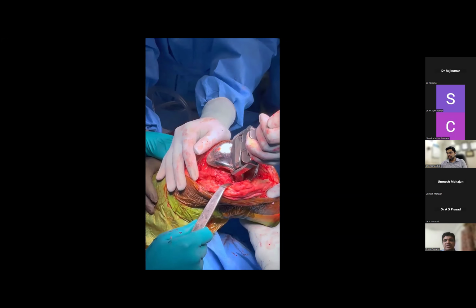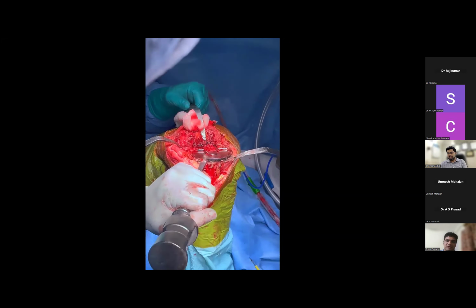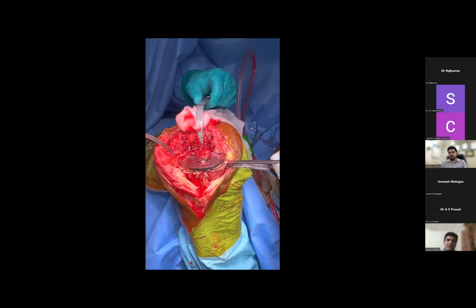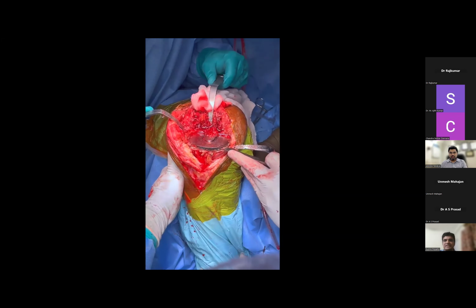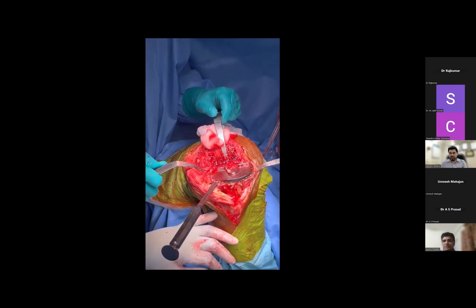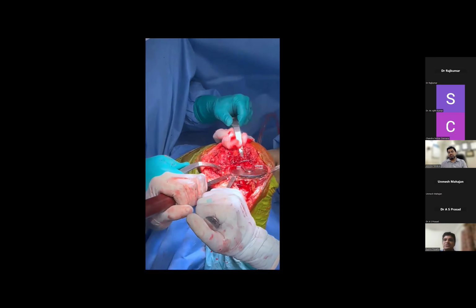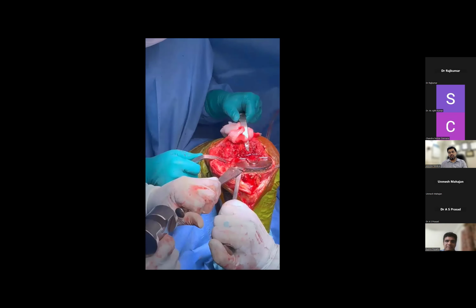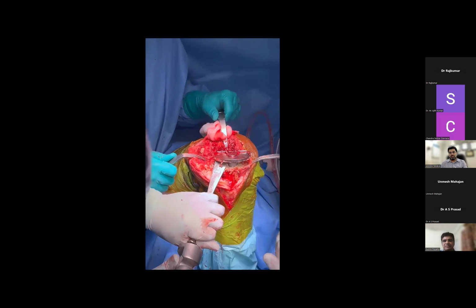So this is how, once the femoral component is removed, one should proceed to the tibia. Again, the same sequence with the saw: you need to debond between the cement and the implant interface. Then with a chisel or osteotome, you need to debond it. One can use the stacked osteotome method as mentioned by Dr. Prasad previously. Sometimes we put one osteotome over another osteotome to give traction so that there will be minimal bone damage. It should be done on the four corners of the tibial base plate, the anteromedial, posteromedial, anterolateral, and posterolateral. Easily the component can come out.